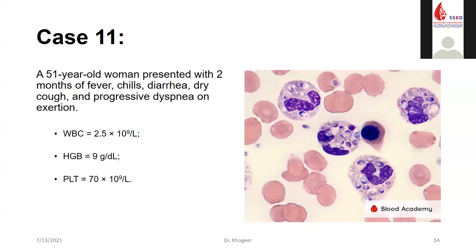So while you are examining the peripheral blood and you see some neutrophils with increased granulation, you can say these are neutrophils showing increased or toxic granulation, likely due to GCSF or growth factor therapy effect. And again, always correlate with the clinical picture. If the patient presented with infection, it is mainly due to infection, but if there are no signs or history of infection and inflammatory process, you have to look for the reason behind this. Usually in GCSF, not all the cells show increased granulation, and you will find some immature cells in addition to the neutrophils.